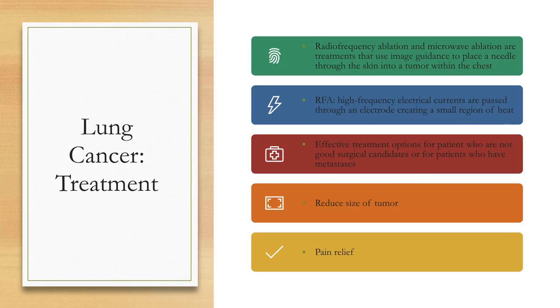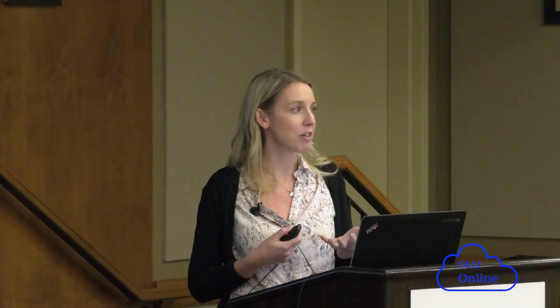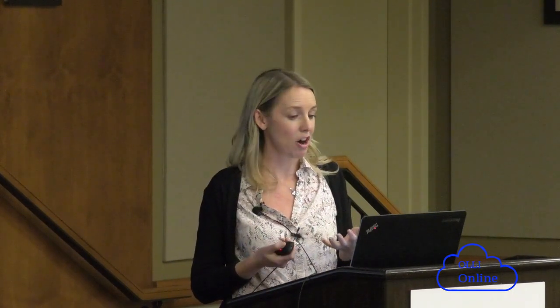As far as radiologists' role in lung cancer treatment, we're doing more and more of what's called radiofrequency ablation. There's also microwave ablation. At St. Jude, we're just doing radiofrequency ablation. Basically, we place a needle through the skin into the chest. It's a special probe that releases electrical currents into that area of the mass and creates heat, killing the tumor. So this is a really effective treatment for patients who are not good surgical candidates, have comorbid conditions, cannot undergo a major surgery, or for patients maybe that have multiple metastases and some are responding to chemo and some aren't. So then we can target those ones.